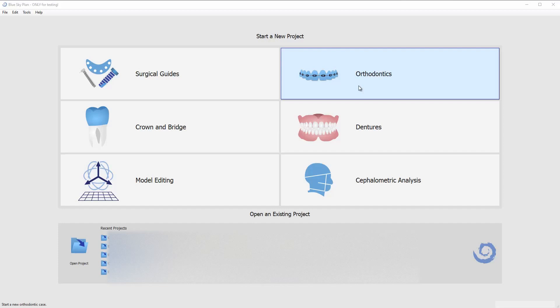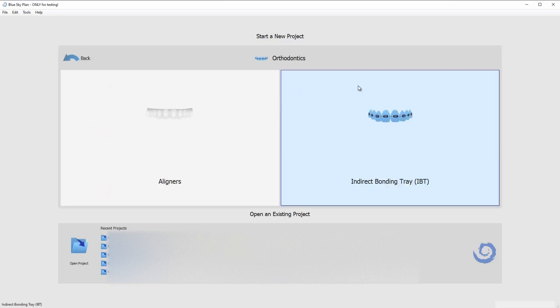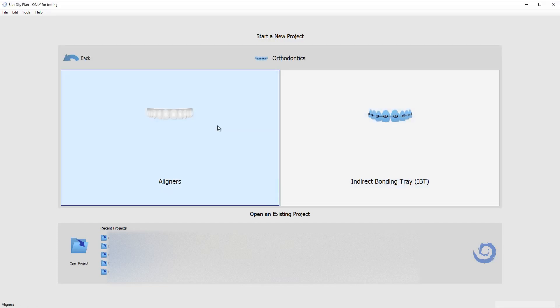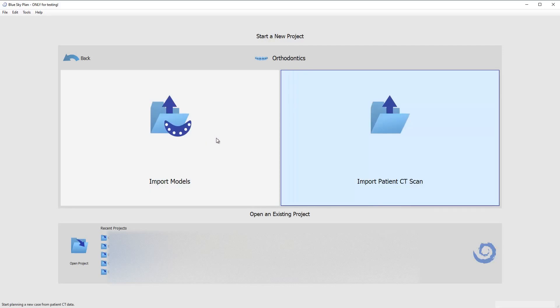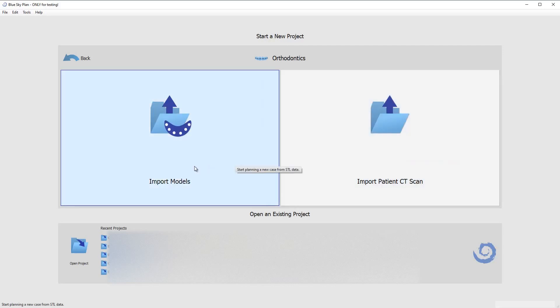So to get started for an orthodontic case I am going to click on the orthodontics button and then I'm going to click on aligners. Import models. If you pick CT scan you're actually going to bring a CT scan in as well to overlay the model on it and so you can see where roots are. See how much bone volume you have.